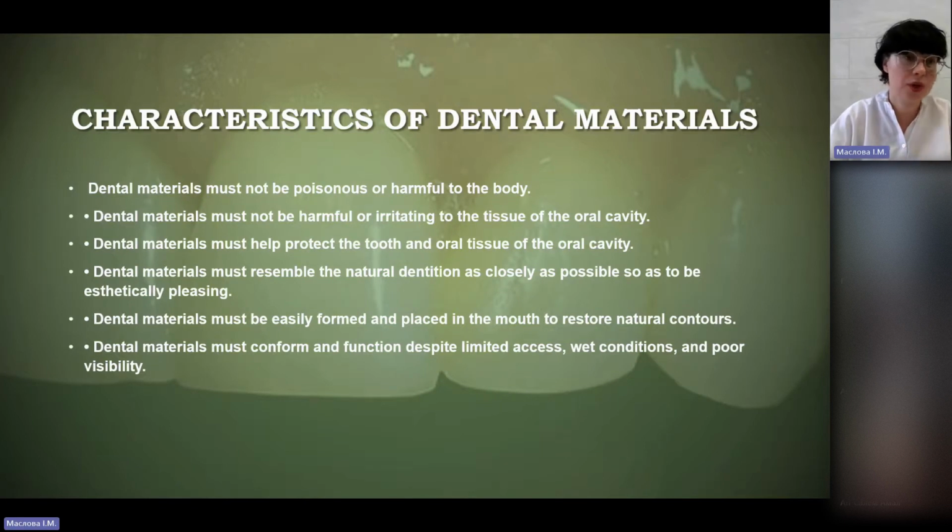First of all, before we start to discuss characteristics of dental materials, some words about special cavity preparation techniques. You often will use the classic preparation techniques. It's very difficult, but on the other hand, it has very simple principles and requirements of preparation. But in some cases of dental caries lesions, you can use alternative or special cavity preparation techniques.